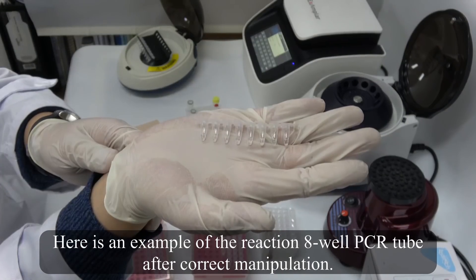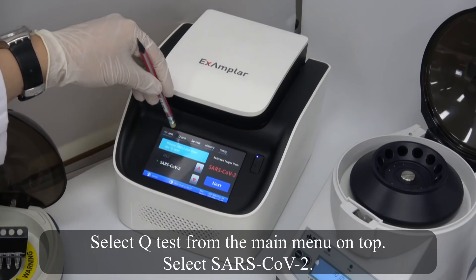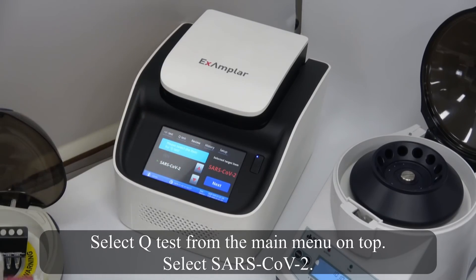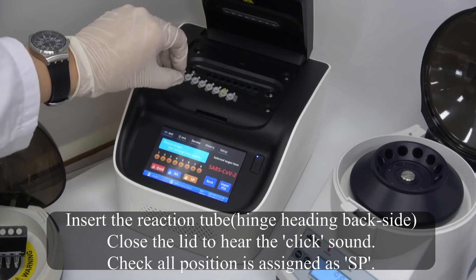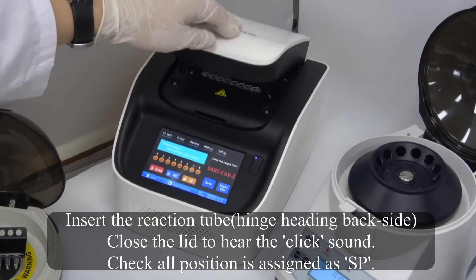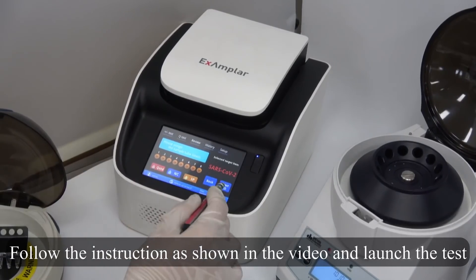Here is an example of the reaction tube after correct manipulation. Select Q test from the main menu on top. Select SARS-CoV-2. Insert the reaction tube with the hinge facing the backside. Close the lid to hear the click sound. Check that all positions are assigned as SP. Follow the instructions as shown in the video and launch the test.